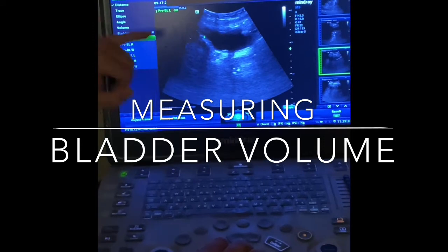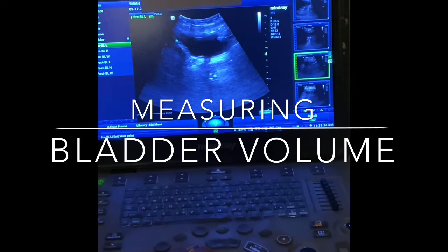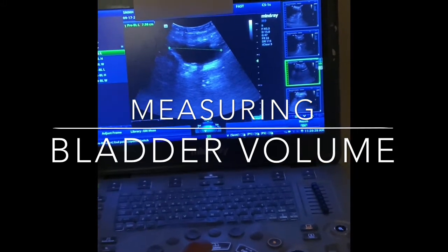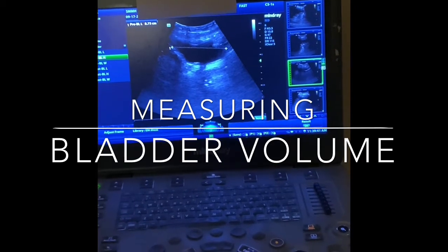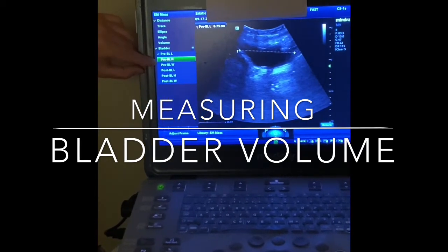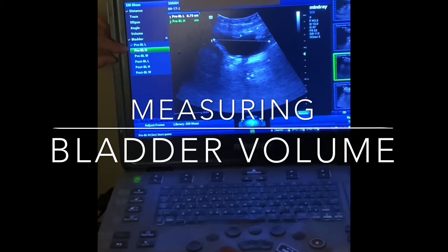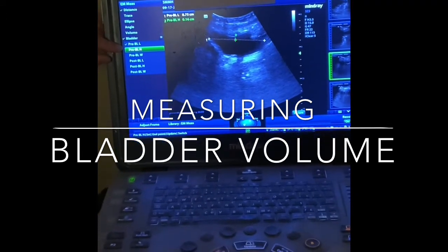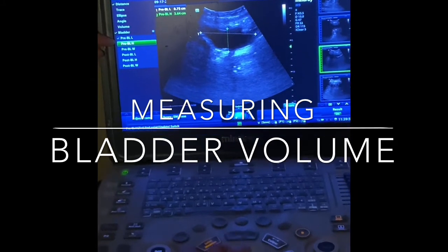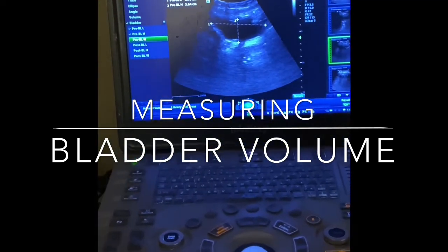So I start by measuring the bladder from left to right. I move it to the largest area, I press the click button, and then I move it over to the other side, and I press the click button again. Now you see that there is a check mark by the first measurement, and it automatically defaults to the second measurement. I will again move the cursor and measure it now from top to bottom. And you could be generous in your measurements, as this often undermeasures. Now you could see there's a check mark by the second measurement, and it defaults to the third.